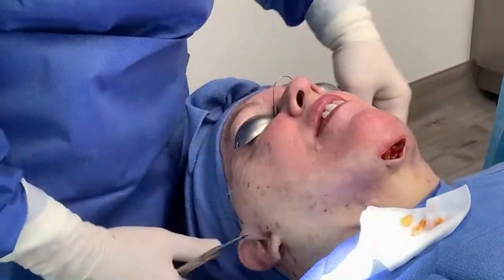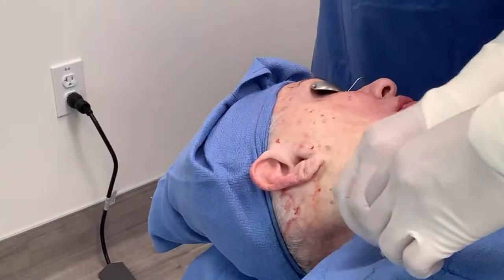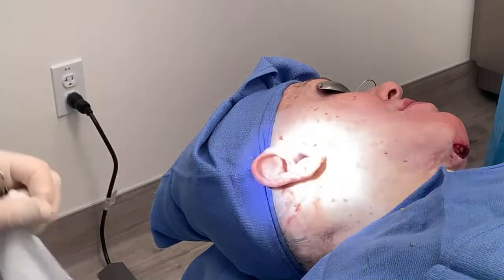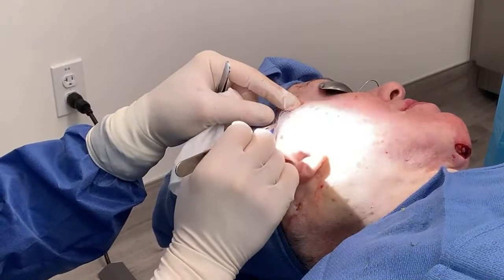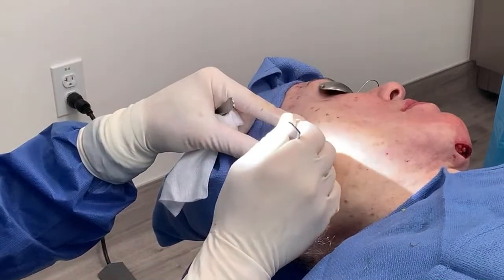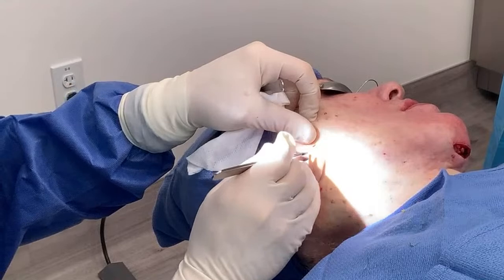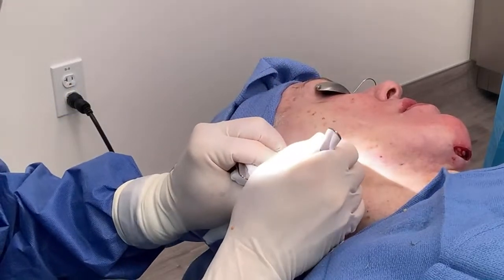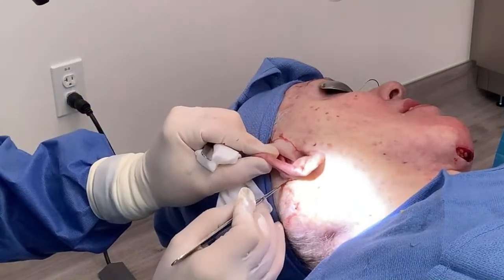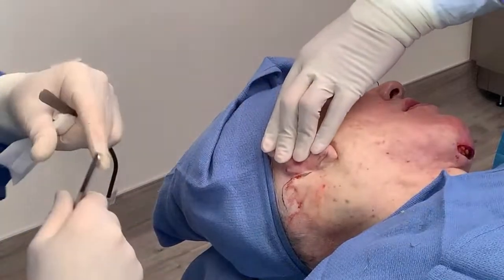Ready? Great. Now I'm going to turn your head all the way this way. So we make a hair-sparing incision that hides nicely. If you feel pinching, you let me know. You'll feel some pressure here. Very good. So this hides in the creases of the ear very nicely. And then the post-auricular incision. You feel a little pinch there or not really? Just a little. Let me do some numbing medicine.